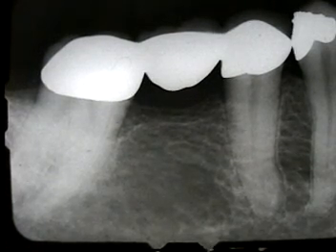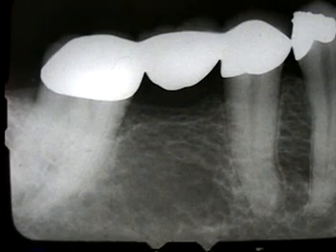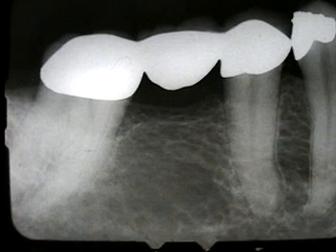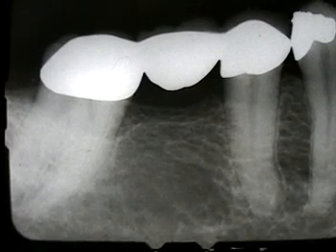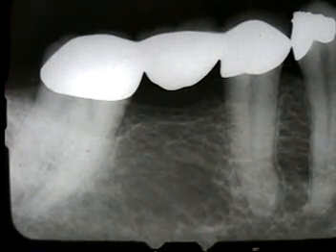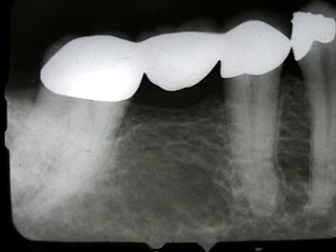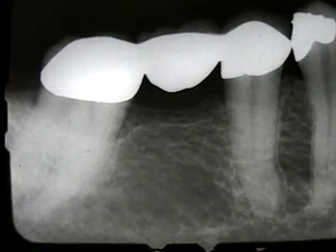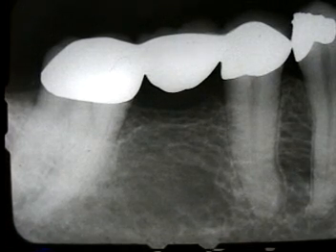Here we have a three-unit fixed bridge on the lower left quadrant. The patient has a severe toothache, and by percussion test it's difficult to tell if it's the first molar or if it's the bicuspid. Since the bridge is connected together, we're going to take the bridge off and see if we can determine where this pain is coming from without opening up both teeth.